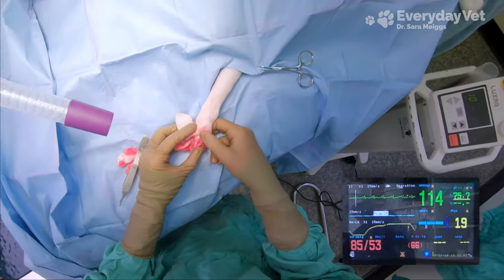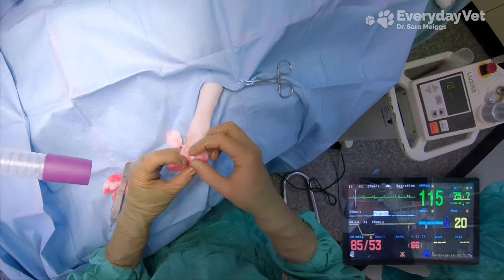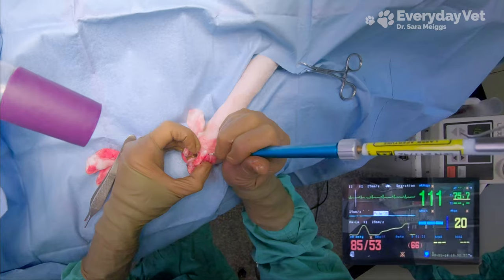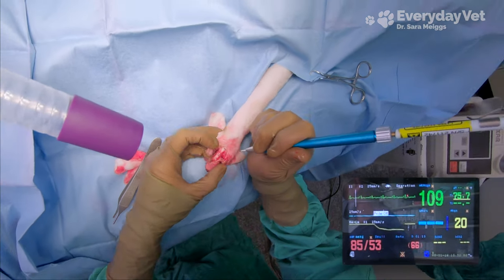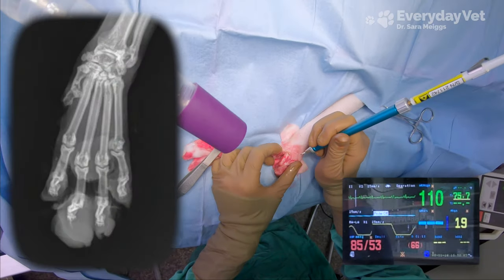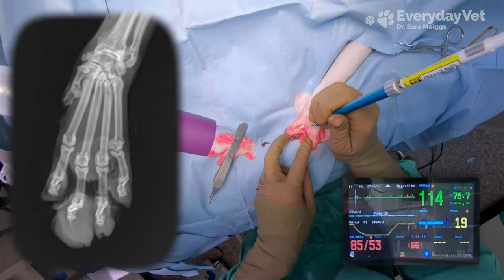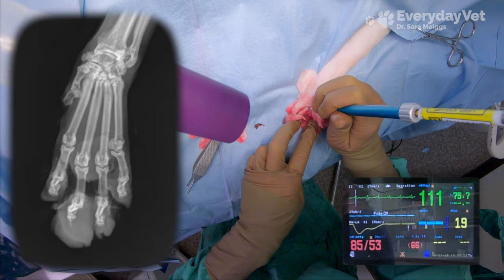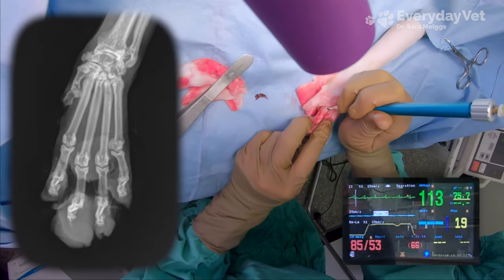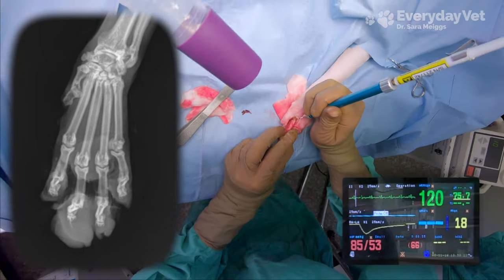As I'm continuing to dissect around the toe and try to free it up from its neighbors, I'm constantly feeling where the joint space is, because I need to make my amputation at the joint — that way I'm not going to have to cut through any of the bones. I planned which joint to target before even starting the surgery. Beforehand, I took an x-ray of his foot because on the x-ray the tumor tissue shows up a lot brighter than the surrounding tissue since it's more dense. I was able to use that x-ray to see where the edge of the tumor was, compare it to the underlying bones, and from that decide on which joint to do my amputation at.